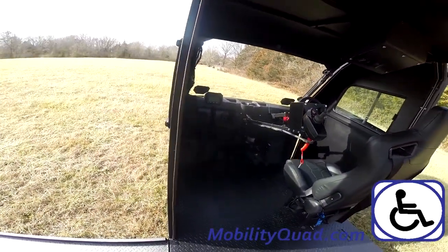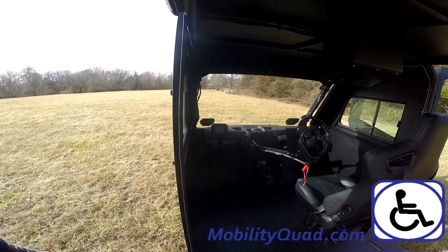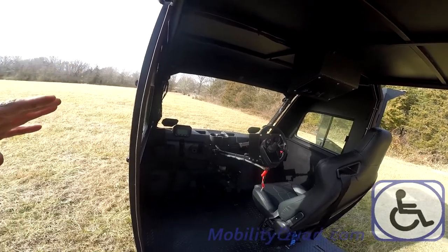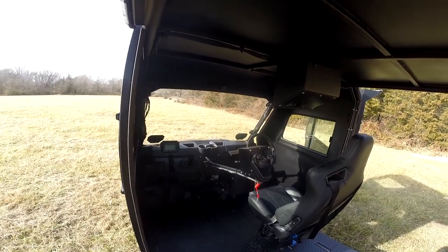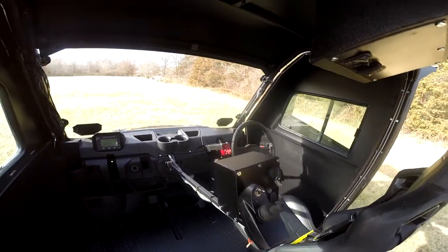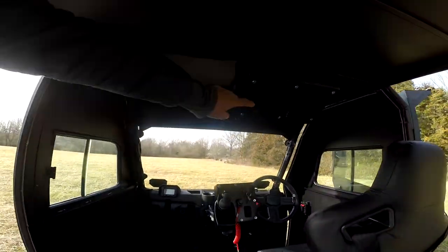The person that this UTV mobility quad was commissioned for absolutely wanted to drive from the driver's side. However, we put the steering wheel on the passenger side, so that when he is driving, if he gets into any problems or needs assistance, the passenger can take over and drive. That's why we have the brakes and the throttle on the passenger side along with the steering wheel. The person in the wheelchair on the driver's side, on the left, has control.